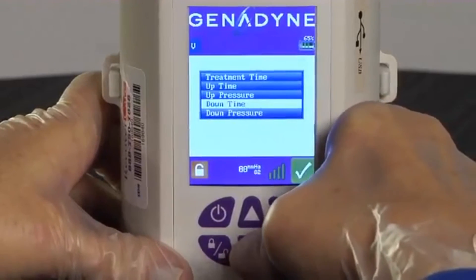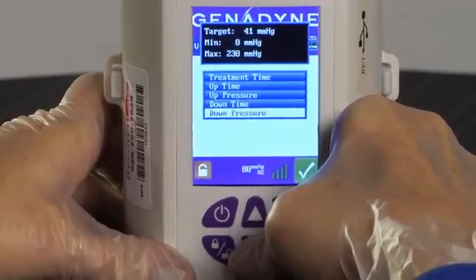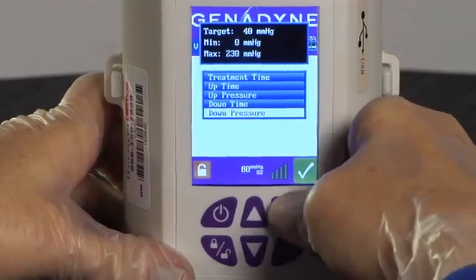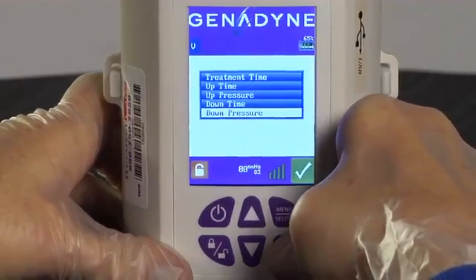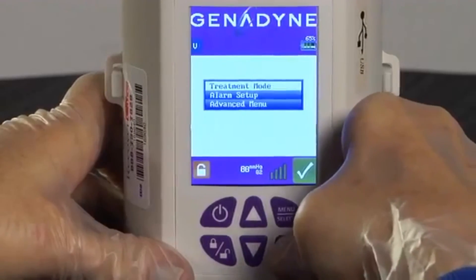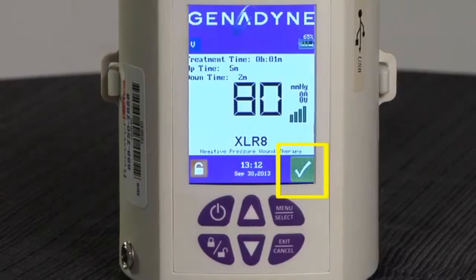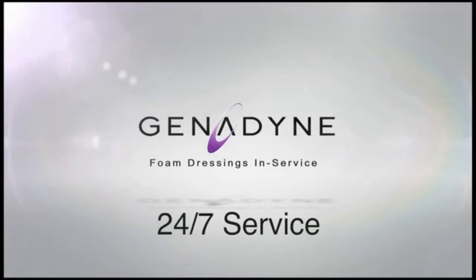To set the down time, use the Up or Down button to select down time on the menu. Press Menu Select again and, using the Up and Down buttons, set the down time at 2 minutes. This means the pump will draw at the lower pressure for 2 minutes before switching back to the higher pressure. To set the down pressure, scroll to the down pressure, press Menu Select, and use the Up or Down buttons to set the down pressure to negative 40 millimeters of mercury. Press the Menu Select button again to confirm the setting. To exit programming mode, push the Exit Cancel button 3 times or simply hold it for 5 seconds. The pump will display a checkmark in a green box during therapy if all systems are working properly. Genodyne provides 24-hour, 7-day-a-week clinical support.